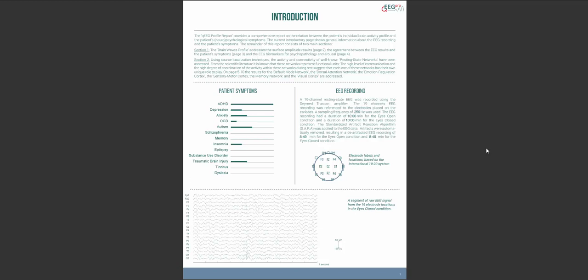For the EEG recording you can read about what type of EEG amplifier was used as well as the sampling frequency and the recording duration for both the eyes opened and eyes closed condition. At the bottom of the page a sample of the raw EEG of the patient is depicted to give a general impression of what the EEG looked like.